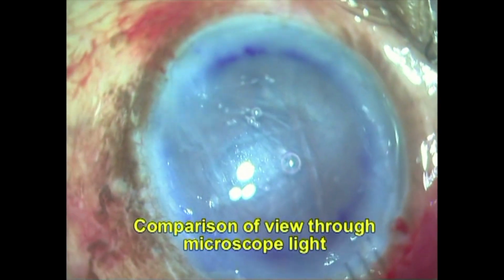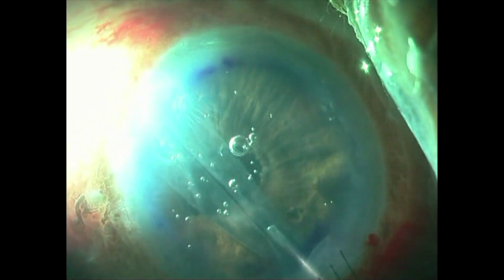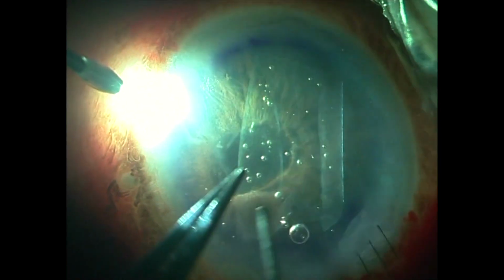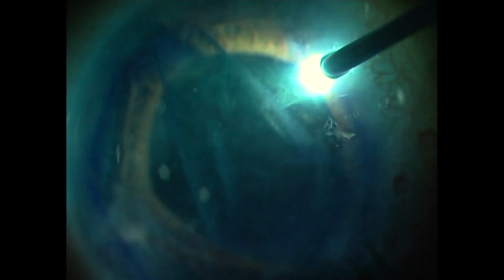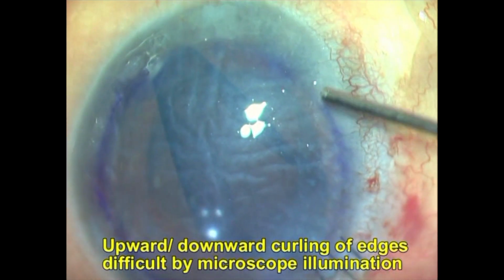The unfolding of the graft can also be carried out with just the endo-illuminator light alone, and this gives a very good clarity to the surgeon, as you can see here, as opposed to the microscope light, where it is very difficult to make out whether the graft is facing upwards or downwards. You can see here the visualization is improved as compared to a very poor understanding of the graft with the microscope light alone.